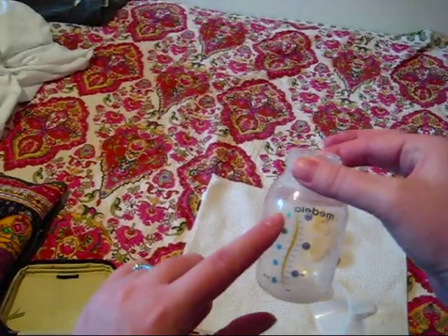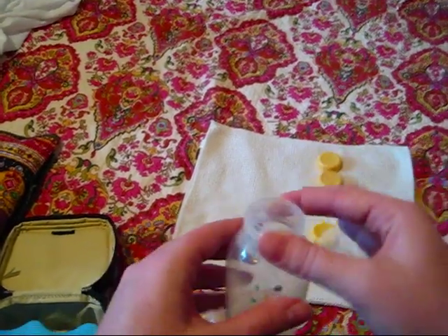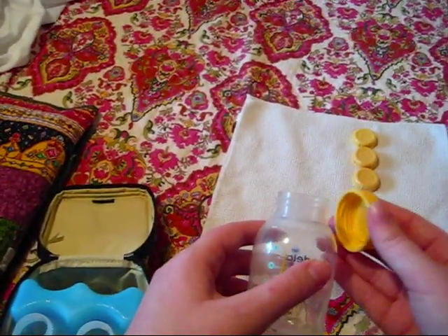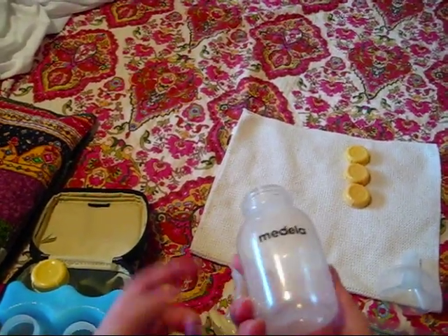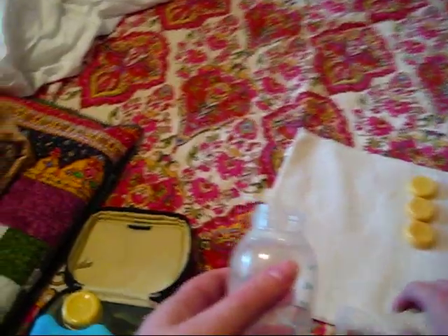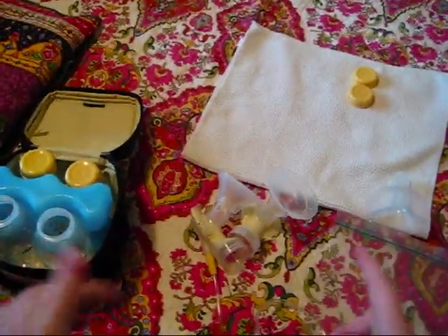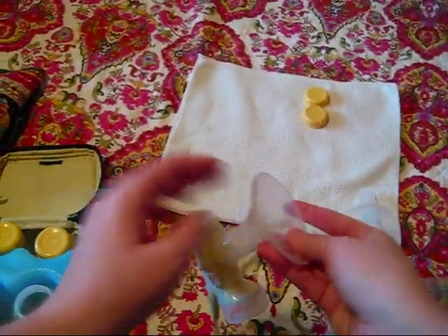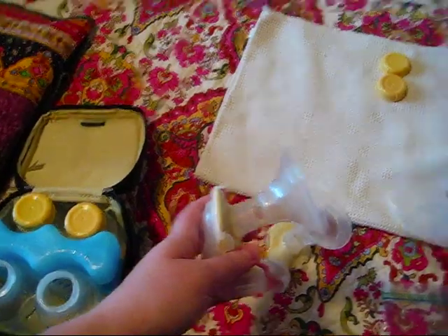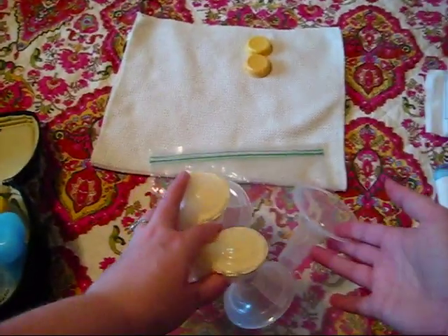Then I look at how much milk I pumped — usually between three and four ounces combined, which isn't great but it is enough to feed her. I cap the full bottle of milk and put it in my ice pack. The now-empty but dirty bottle gets a lid on it and goes in there too. Then I run water through the pump pieces, rinse the hard shield, and put everything into my Ziploc bag.